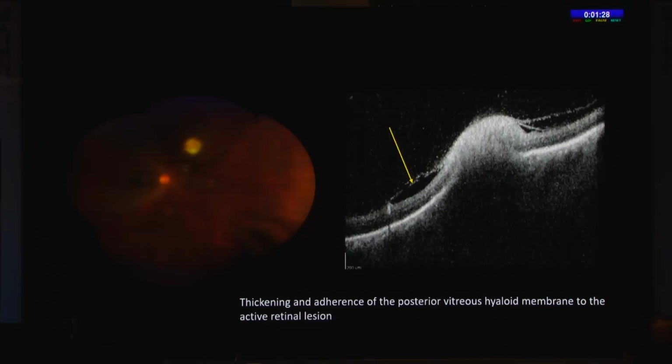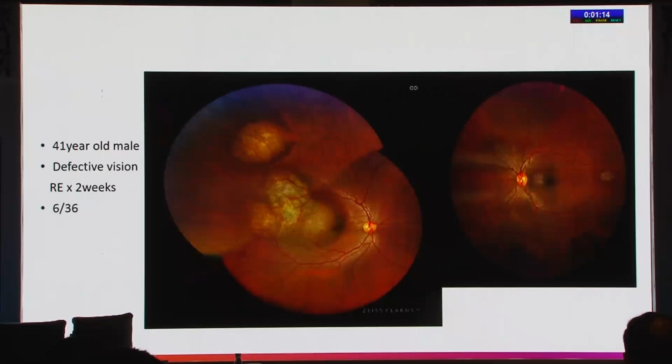When you see a focal retinochoroiditis, and if you see this sign in OCT with a retinochoroidal lesion with an attached hyaloid, don't think twice, it is ocular toxoplasmosis. Treat them with Bactrim and azithromycin with oral steroids, it responds.